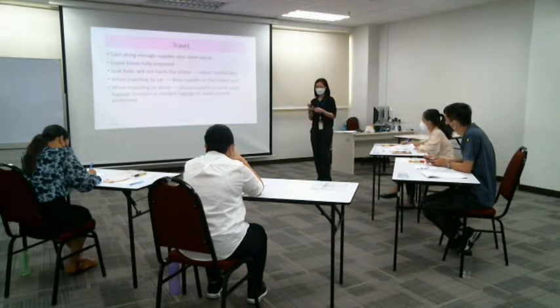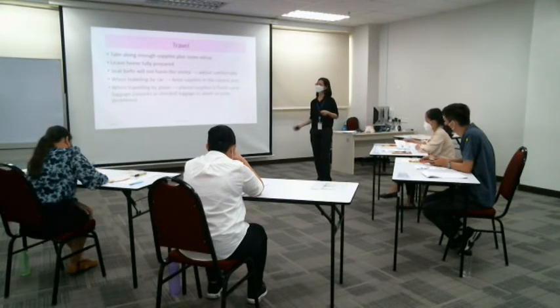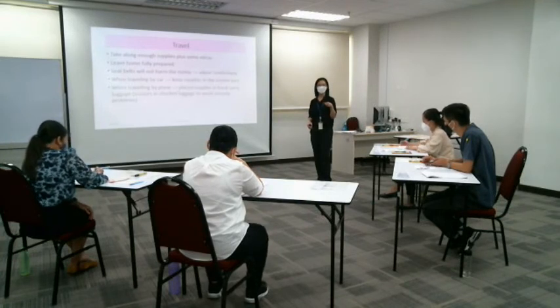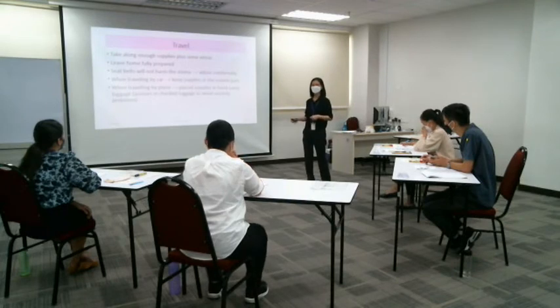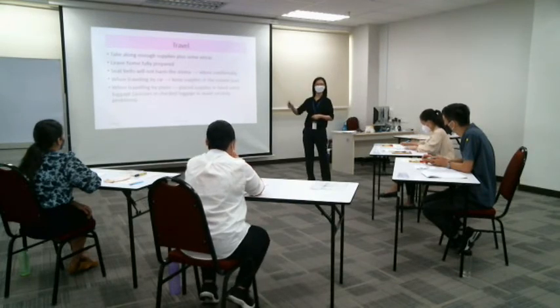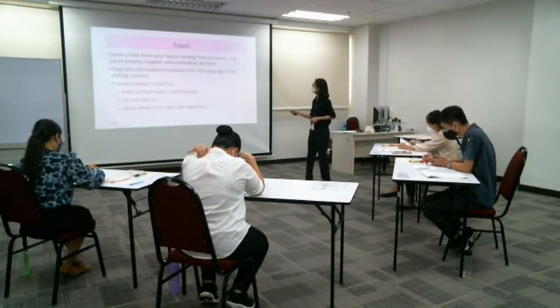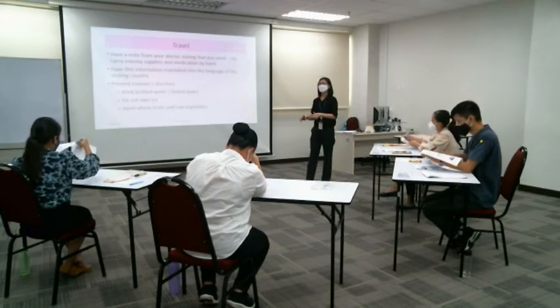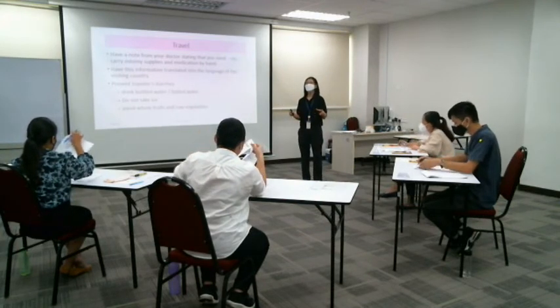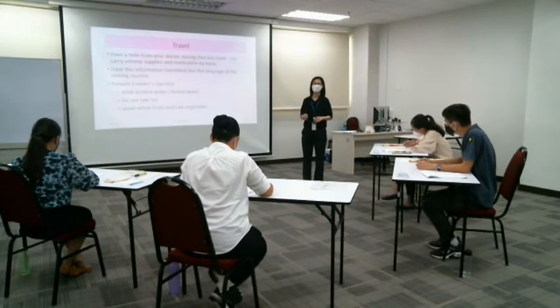Okay? So scissors, you need scissors for cutting. Scissors put in the checked luggage. Declare first and check in. The rest I put in my hand luggage, to prevent the situation where I reach the place already and my luggage goes somewhere else. Alright. Have a note from your doctor stating that you need to carry the ostomy supplies. So this can reduce the trouble of having to explain to people or the customs officer.